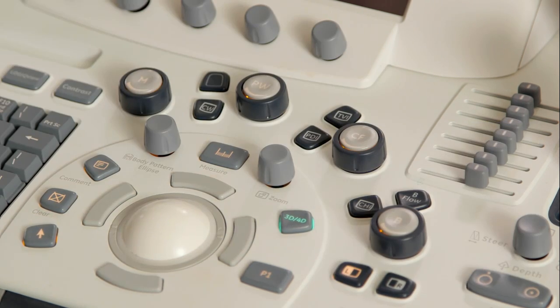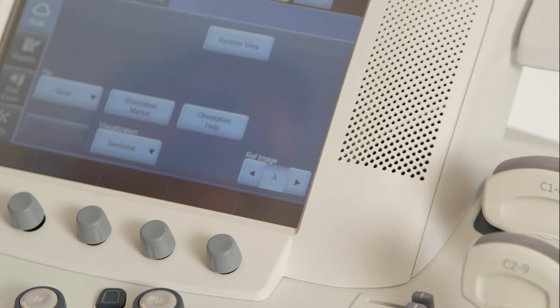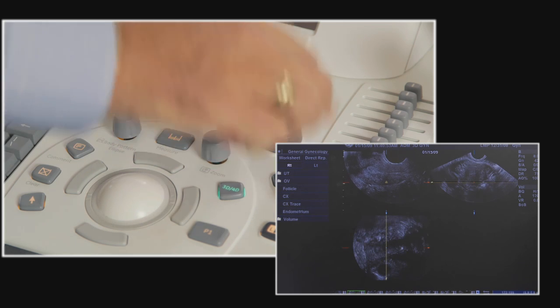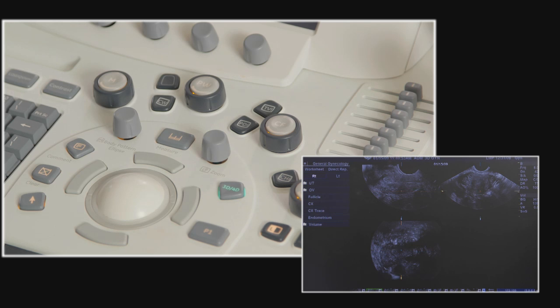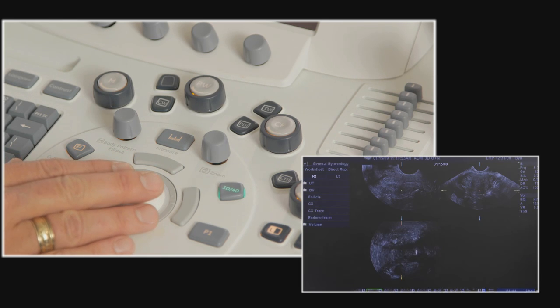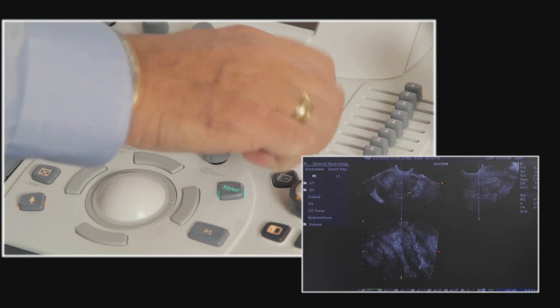You can use the Z-rotation method using only the color flow knob to get coronal images similarly to the described method with freehand volume datasets. Activate the A reference image and rotate until the endometrium is horizontal. Then activate the B reference image and do the same using the color flow or Z rotation knob. Then place the axis dot using the top trackball key in the endometrium or any area of interest. You will see a good representation of the coronal endometrium in the C plane. If you wish, you can rotate this image to be anatomically correct using the same color flow knob.